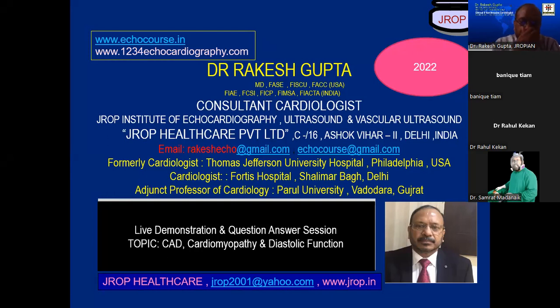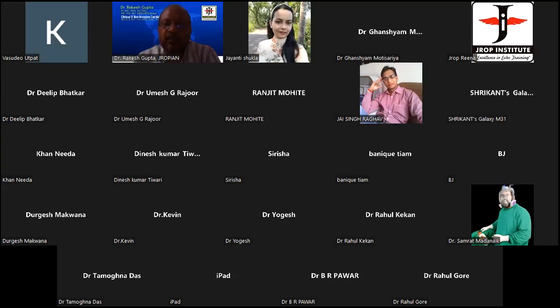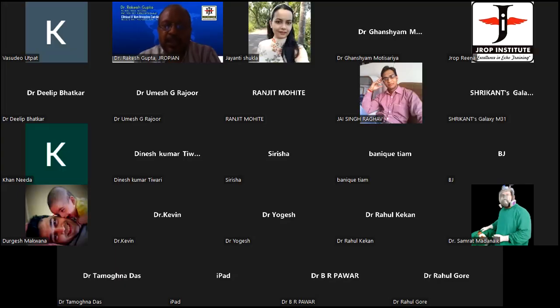We have talked about coronary artery disease, systolic and diastolic function, and cardiomyopathy. We are going to talk about this session again in the form of live demonstrations from my echo pack, as well as a question and answer session, where all of you are bound to ask anything you have in mind, which I should be able to show by live demonstrations. With these few words, let me move on and share my slides of an echo pack, where I'll be able to show a live demonstration of all these things one by one.